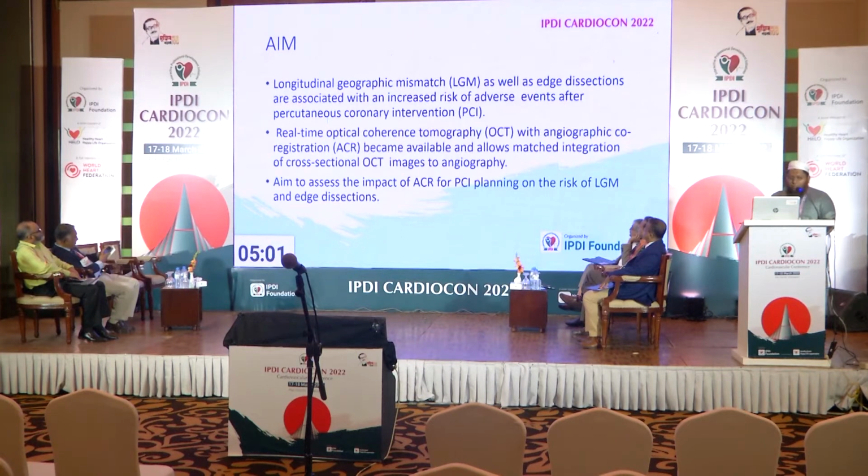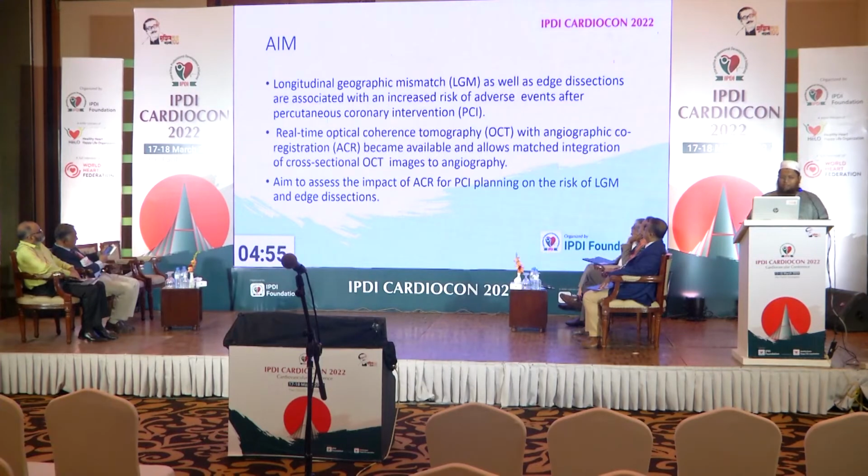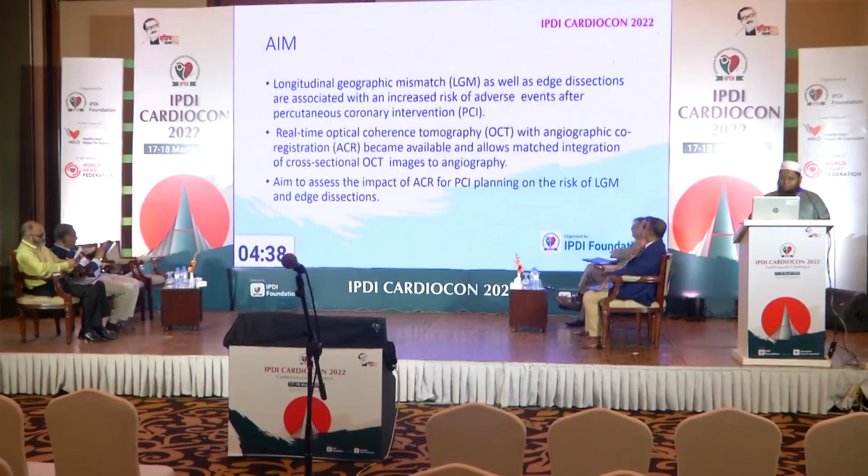The aim of this study: longitudinal geographic mismatch as well as edge dissections were associated with increased risk of adverse events after percutaneous intervention. Real-time OCT with angiographic co-registration is available and allows integration of cross-sectional OCT images into angiography. We aim to assess the impact of ACR on PCI planning and the risk of longitudinal mismatch and edge dissection.